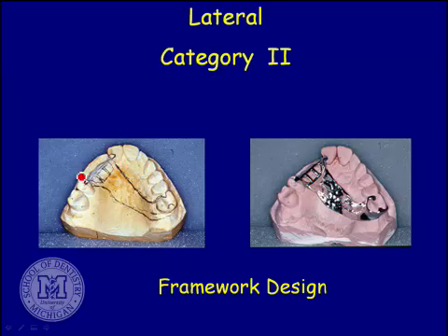Then when we do our secondary tilt, we tilt the thing laterally, and on tilting it laterally, we see the daylight disappear, and we see these things become perfectly parallel. Then that's our secondary path of insertion. So the total amount of undercut available to you on those proximal surfaces is the difference between level and tilted.